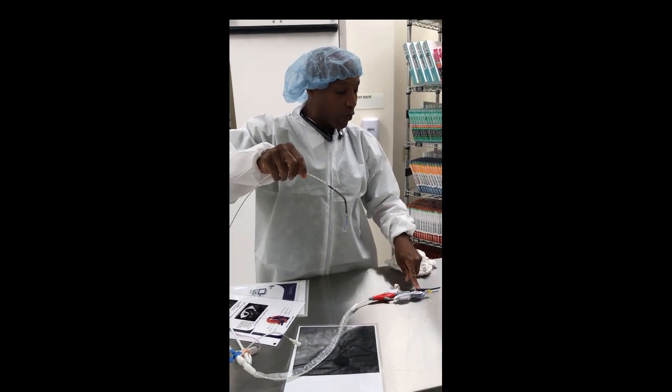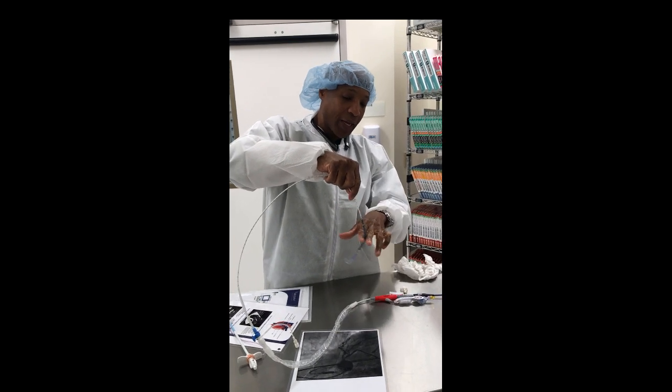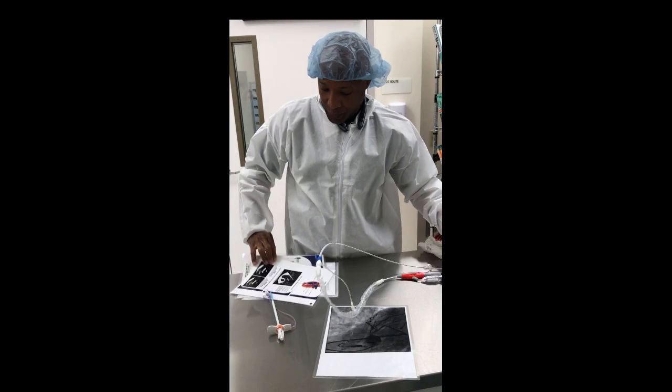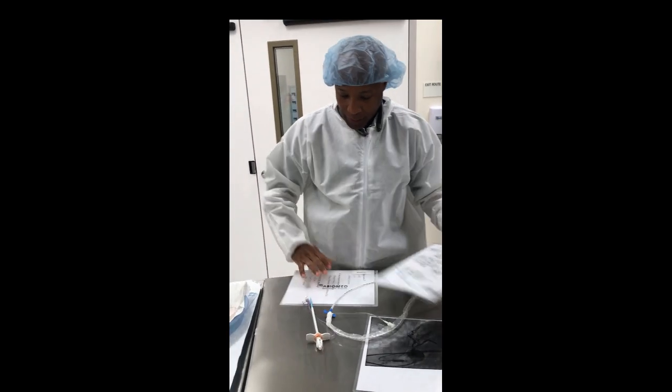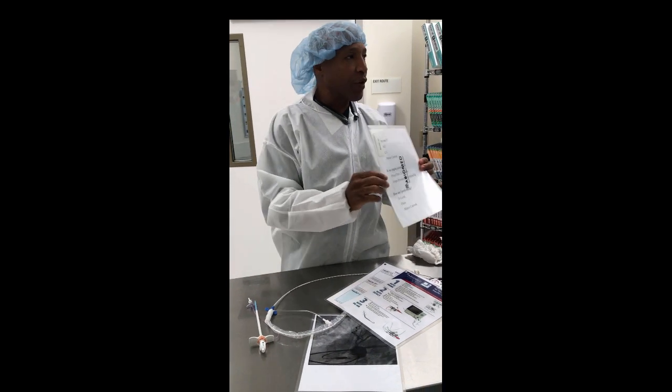So basically, you have a device that when spinning will perform, you can monitor where it is because of the A-line, and we're going to protect the motor as it unloads blood. Those are the three P's. Any questions on how it works or what it is?